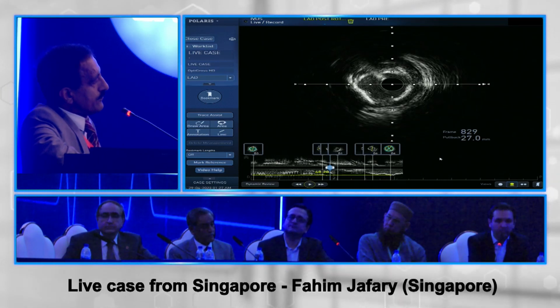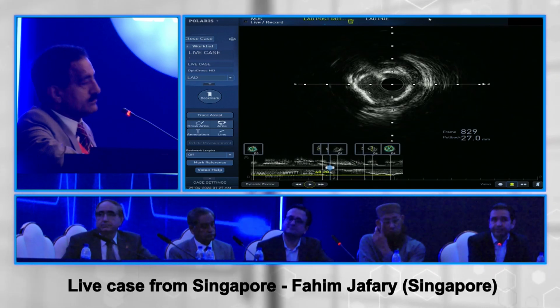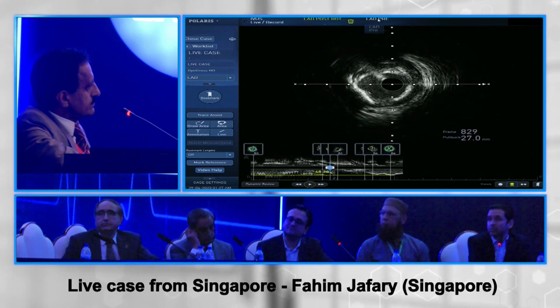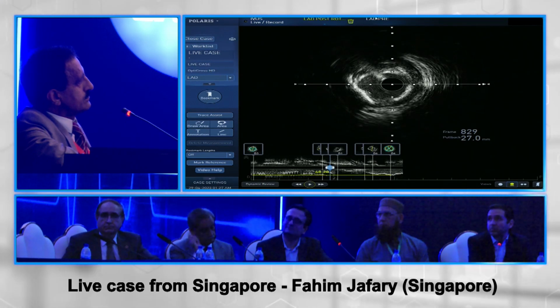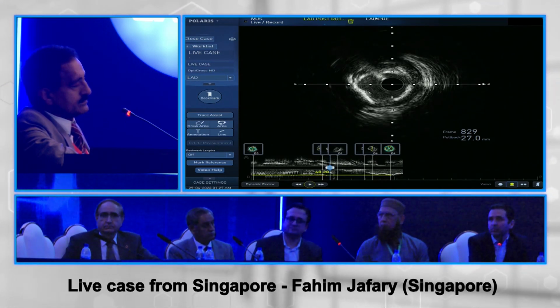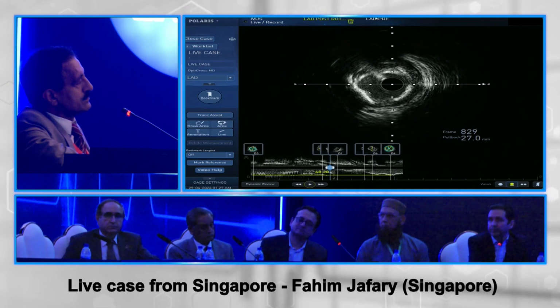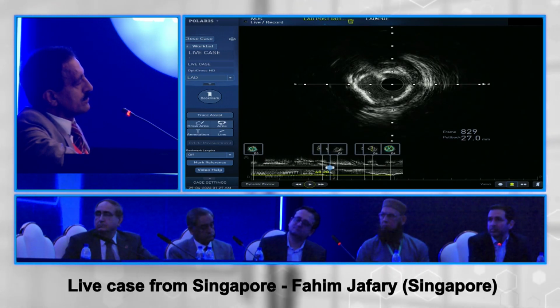I think we knew that there was extensive calcium from the CT, and there's a lot of calcium on the IVUS. The IVUS calcium score is quite high, and we did not want ROTA regret. We felt that it's best to ablate, because once you dilate, you often lose the opportunity to do rotational ablation. So we wanted to throw everything at it. The calcium score in the LAD was about 800, so it is pretty extensive and thick calcium.